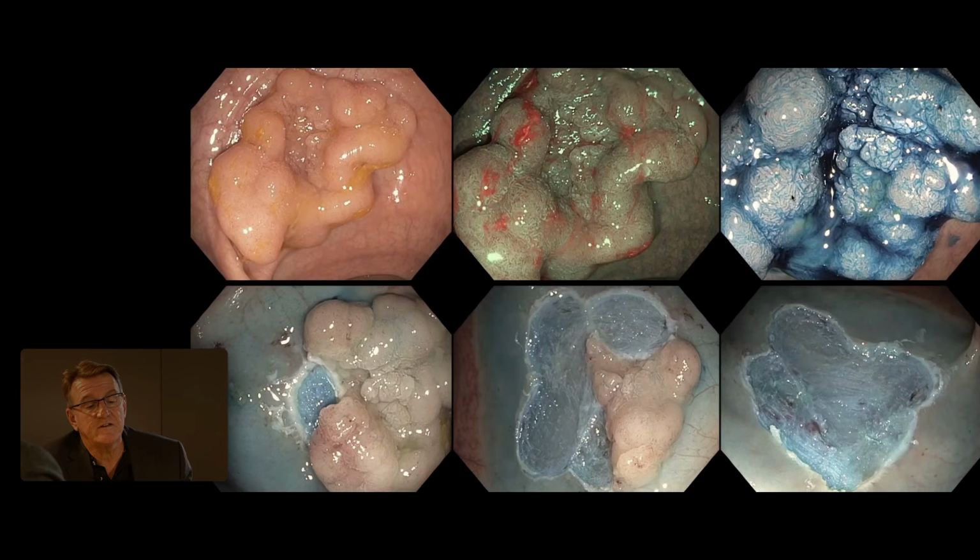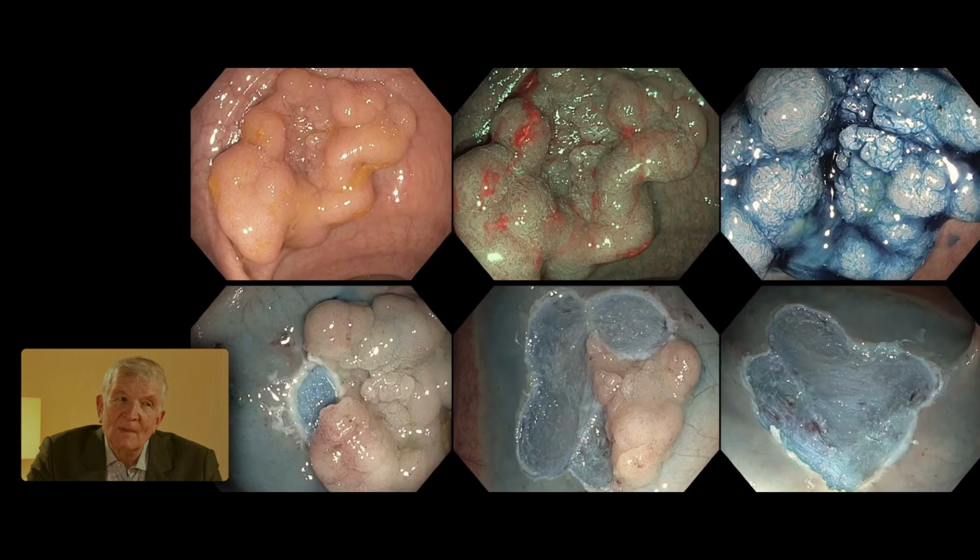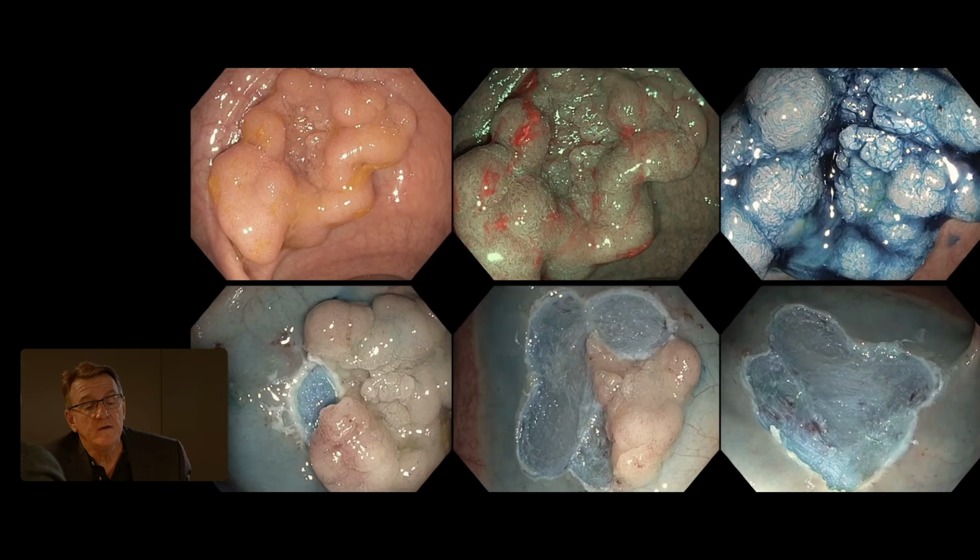You can see here the dye staining is helpful because there's no loss of the pattern. It doesn't seem to be anything to be concerned about. Do you have to deflate a little bit? Deflate and inflate, I think both, and take your time. This is with methylene blue. We showed no incremental benefit in 400 patients. It's published in GIE, I think. So then we just do EMR.